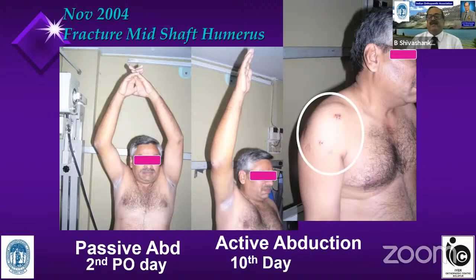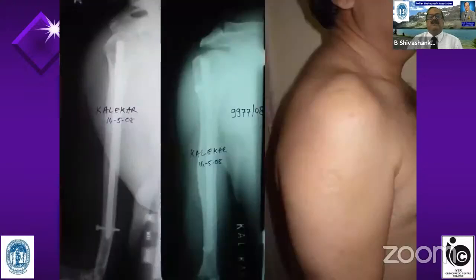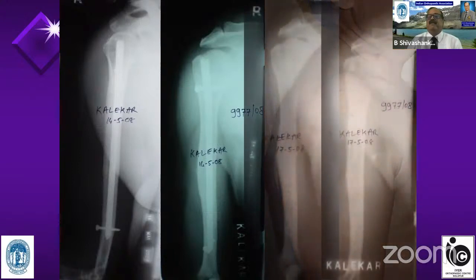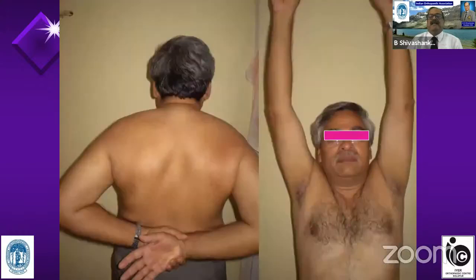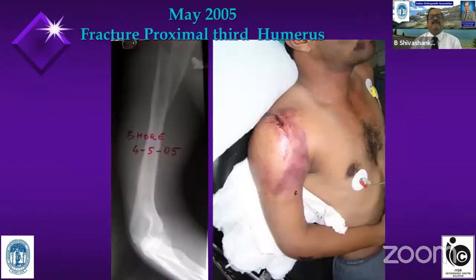This is an advocate. He had a fractured humerus. See the keyhole incision through which I have done the nailing. You can hardly make out the incision when the patient came for implant removal. I almost always do the implant removal, and this is the function about 5 years after the implant removal. I took this clinical picture recently, 4 or 5 years back. Another patient, see the condition of the skin over the shoulder.